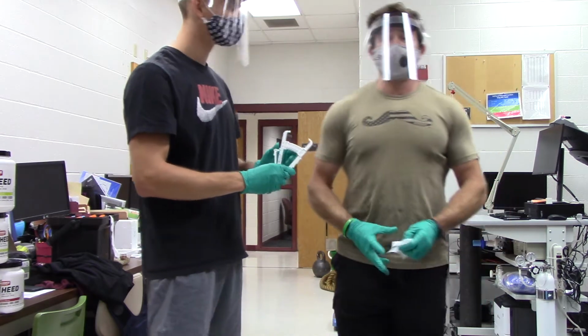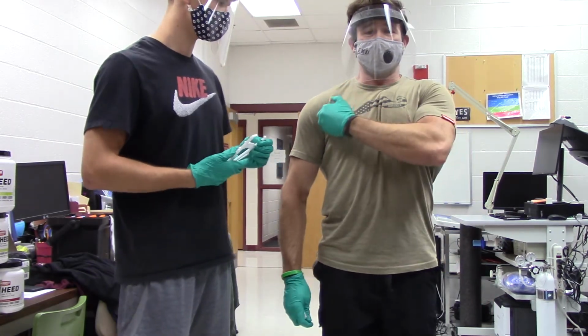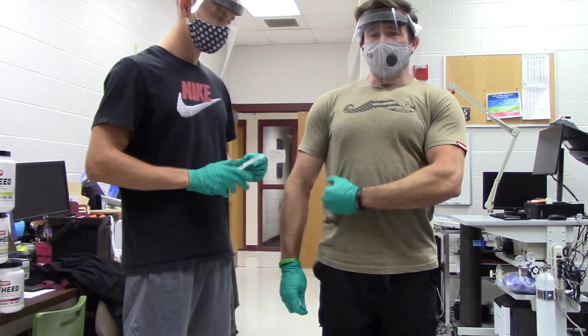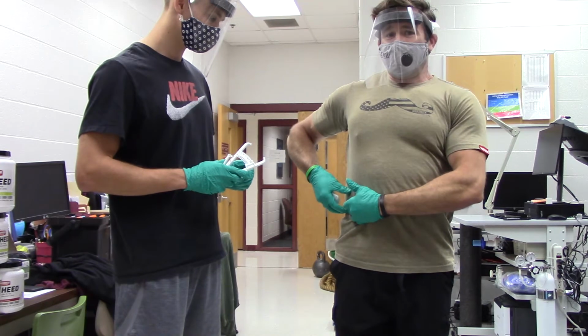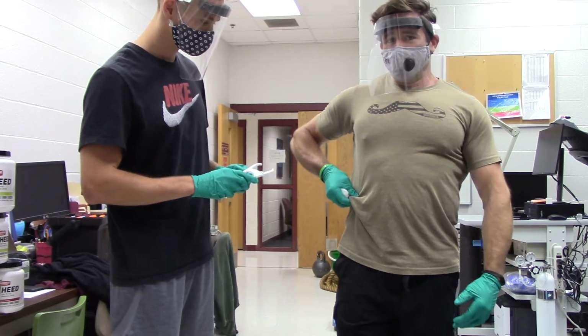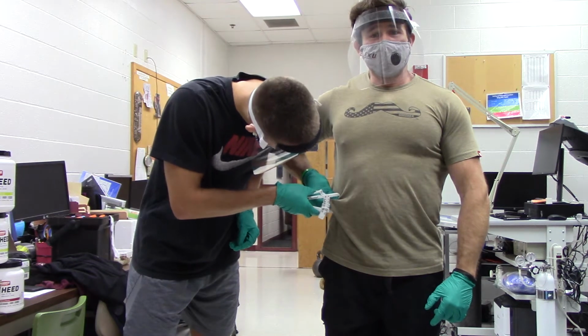But I appreciate it. The next measurement we're going to go ahead and do is going to be the suprailiac. So we take a line from the front of my armpit. It's going to go down until I feel my hip bone. So I'm going to go ahead and feel that. I'm going to grab on the 45 for him, just so it's easy. And then he's going to go ahead and measure, and that's going to be my suprailiac.